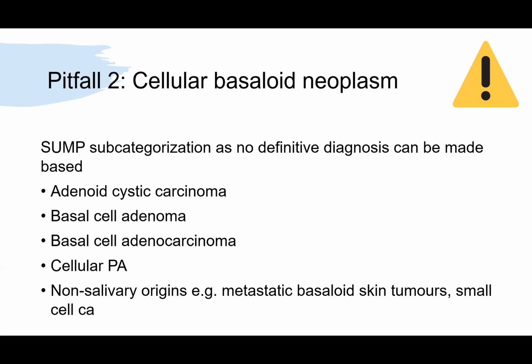These have a huge range of malignancy, but with the Milan classification this is about 35%. Depending on the amount of material and clinical information, you may range a diagnosis from SUMP to suspicious for malignancy, because there may be enough to push it toward suspicious.